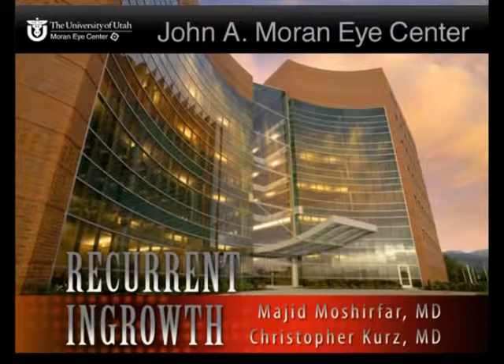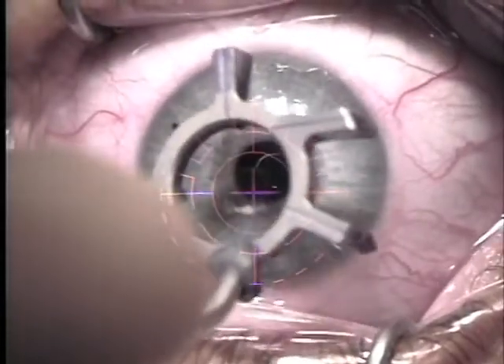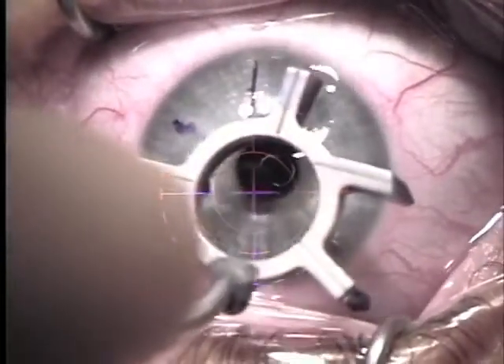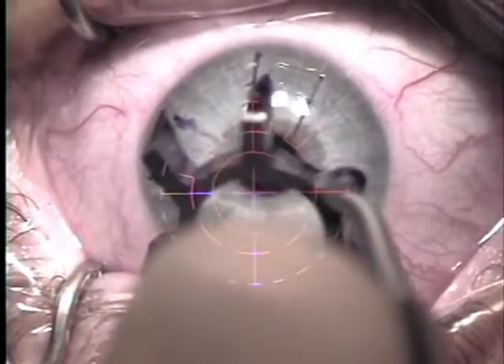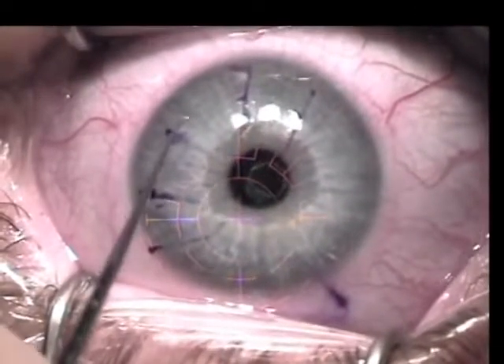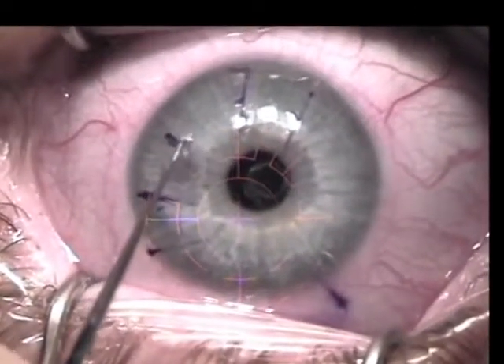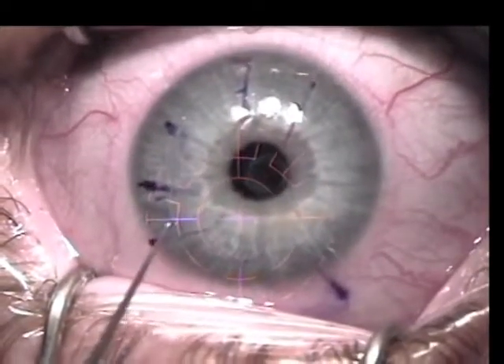This is a case demonstrating the treatment of multiple epithelial ingrowth status post LASIK. The LASIK flap is first marked, and then a Sinski hook is used to free the borders of the LASIK flap for 360 degrees.